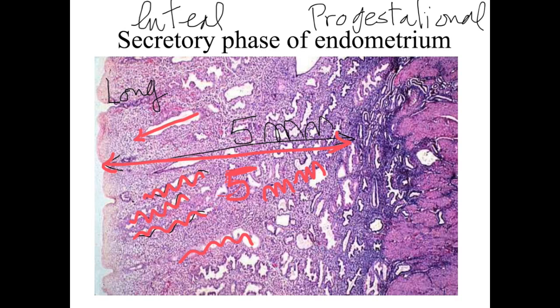These are the visible features here that we can comment on. Of course, another change is the decidual reaction that will appear in the stromal cells. Here the stromal cells become enlarged.